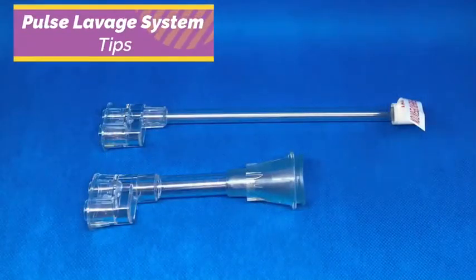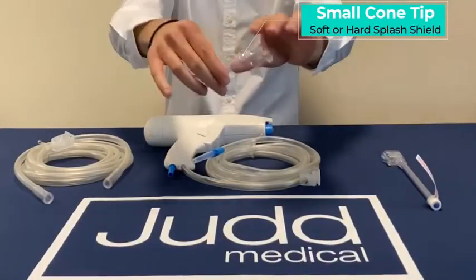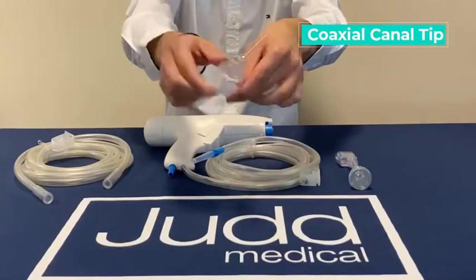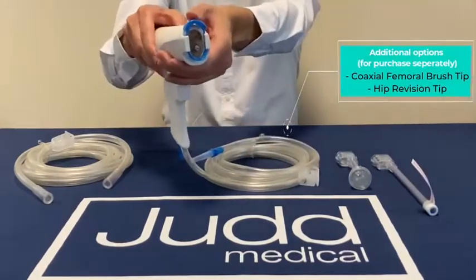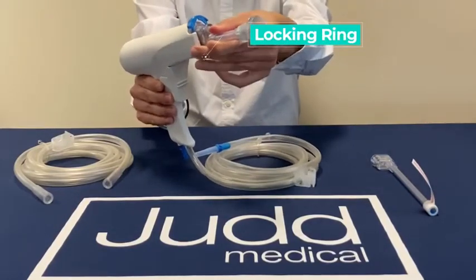Setting up the pulse lavage system is easy. The battery operated handpiece is supplied with both a small cone tip, which offers the choice of a soft or hard splash shield depending on the surgeon's preference, and a coaxial canal tip. The small cone tip and coaxial canal tip are easily connected to the handpiece by pushing them into the distal end and sliding the blue locking ring down.